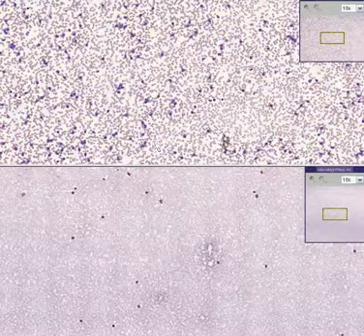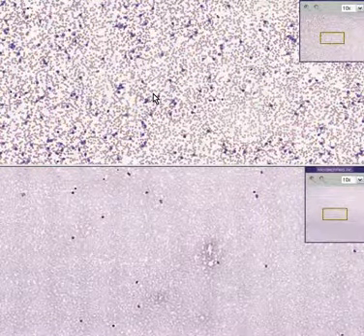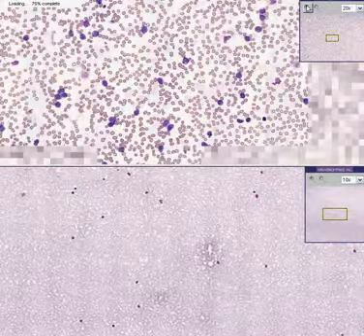It looks like there are about 10 times as many white cells. We don't know what kind they are yet, but if a normal white count is, let's say, 6 to 10,000, would you believe something like this might be perhaps 60 to 100,000? Because it looks like there are 10 times as many white cells here. What could this be? What could the cells be?